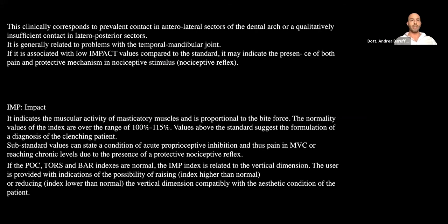An important notice is this, that the torsion clinically corresponds to prevalent contact in anterolateral sectors of the dental arch, or insufficient contact in lateral posterior sectors. It is generally related to the temporomandibular joint disorders. So typically, patients that have torsion, and we will see later some examples, are typically the patients that are symptomatic or likely will be in the future.